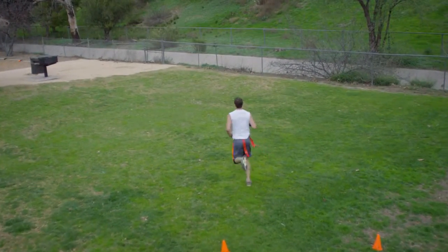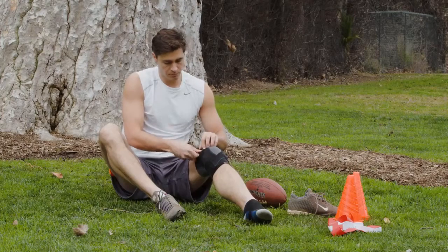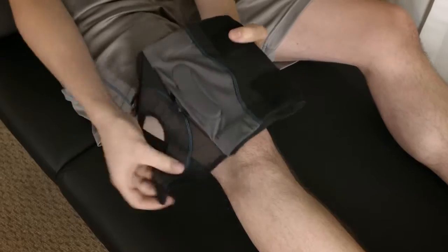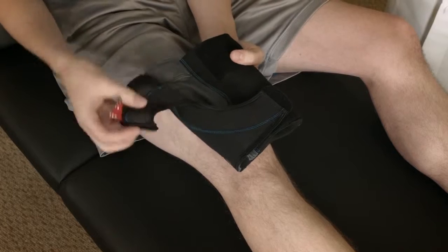Once your activity is over and you want to get off your feet, remove the brace by simply opening the outer flap and sliding the brace down the leg by pulling on the calf banding. Close the outer flap for easy storage.